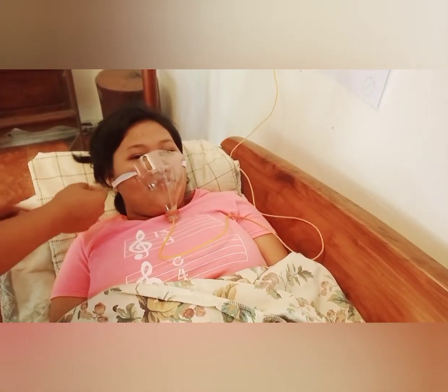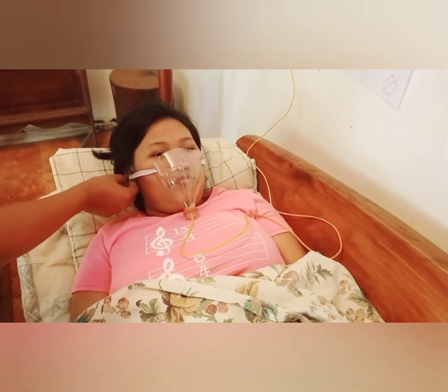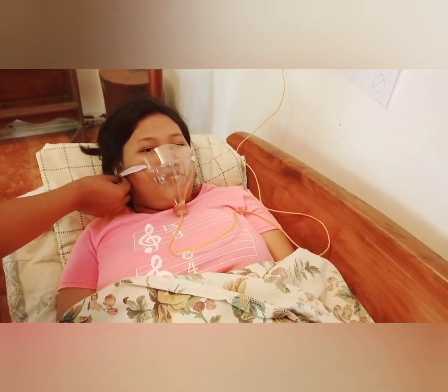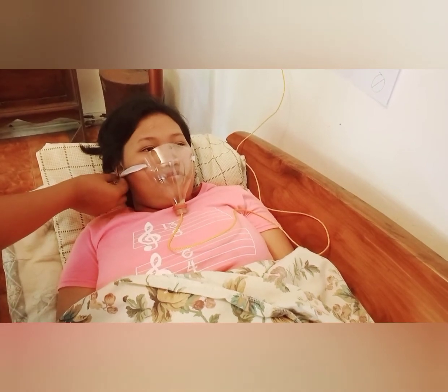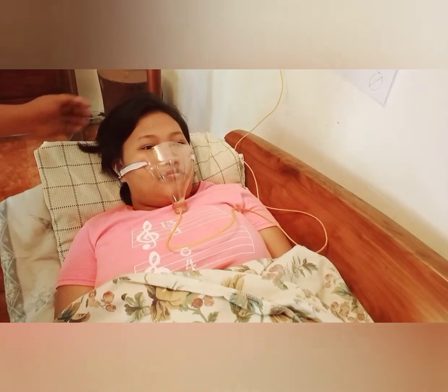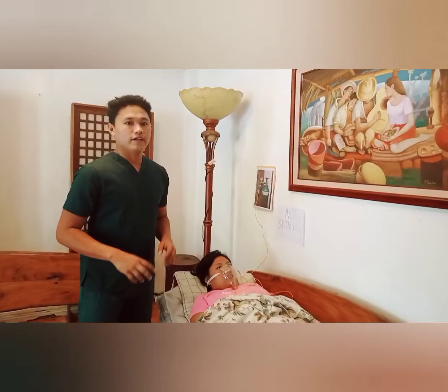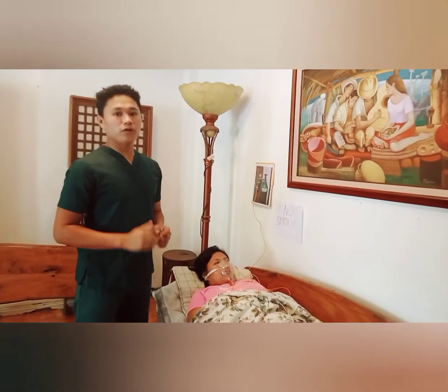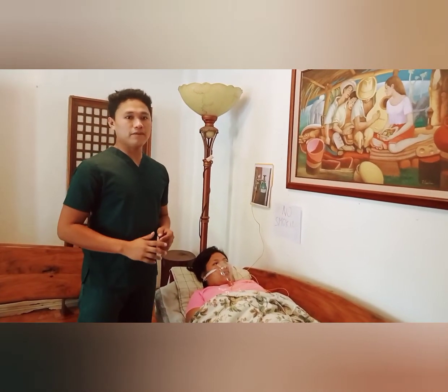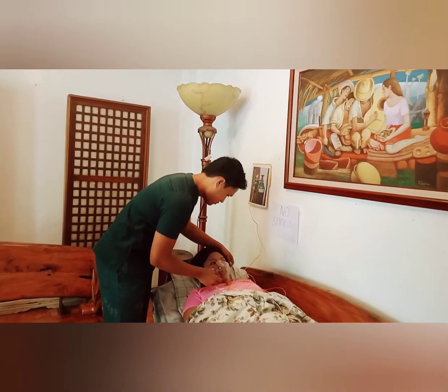Then pull the strap extension to the center. Fit the mask to the client's face with a tight seal. The rationale behind the seal is to prevent leaks as much as possible. And make sure the client is comfortable, which helps to relieve apprehension.